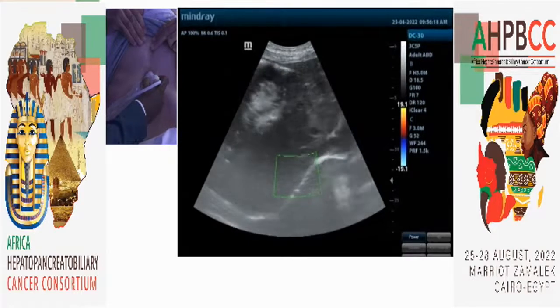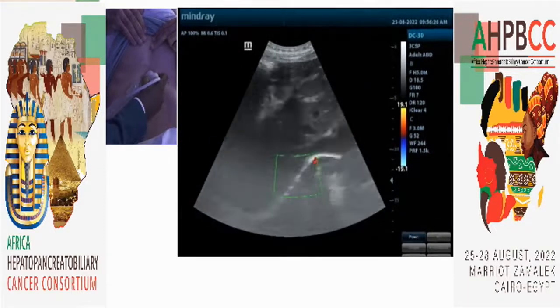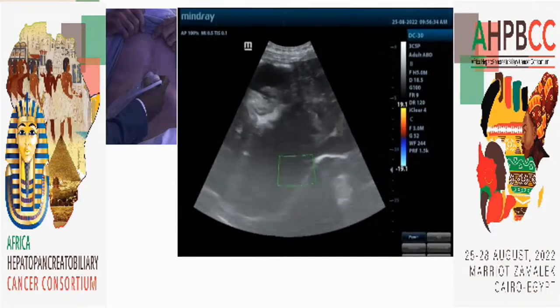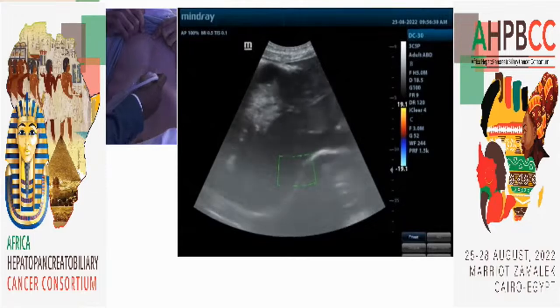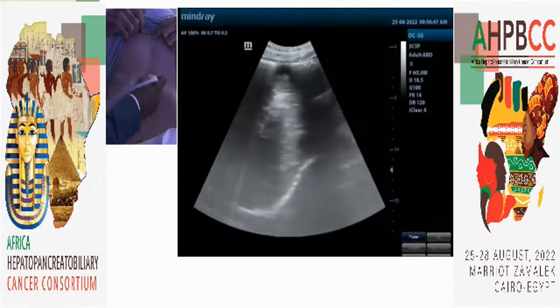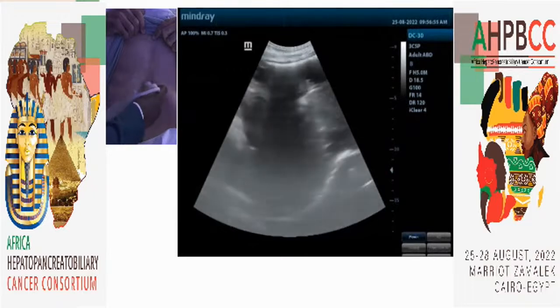So now we have no vascularity in this focal lesion. Take a deep breath, please. Deep breath. The location is difficult. Yes, it's very difficult, small, yes. Apparently, it is difficult to identify flow, so we may call it avascular. I think this is when the superb vascular imaging that you spoke about becomes probably useful in being sure about the presence of a lesion or otherwise.